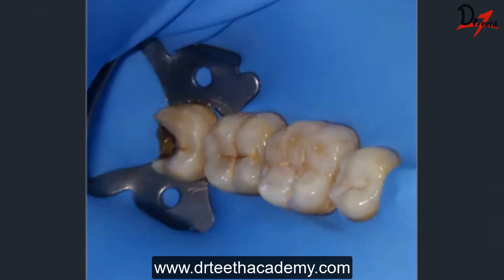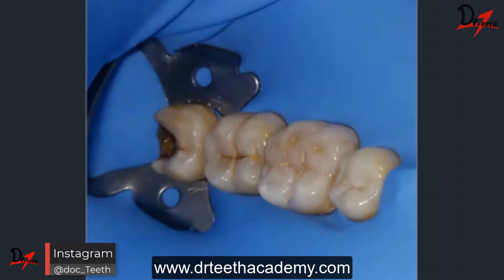First of all, we went ahead with isolation. Without isolation this case might not have been possible, or the results would not be as good. As you can see, after isolation we managed to get a very clean field which is very accessible and easy to work in. I'll show you another picture from another angle which will show how we converted this difficult case into a more manageable one.